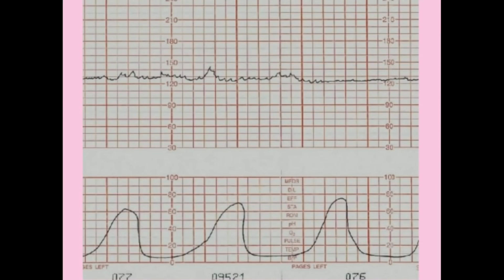So just look at this strip and try to figure out where the baseline heart rate is. You can see that there's variability. Just a little preview of what we're going to talk about. But can you gather where the baseline is? So you look here, these lines 30, 60, 90, 120, 150, 180, 210. And it's about right here, okay, roughly. And that's about 130 beats per minute. So one line above 120.